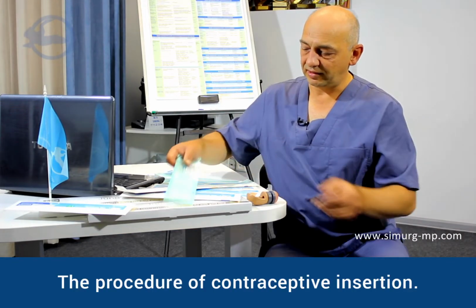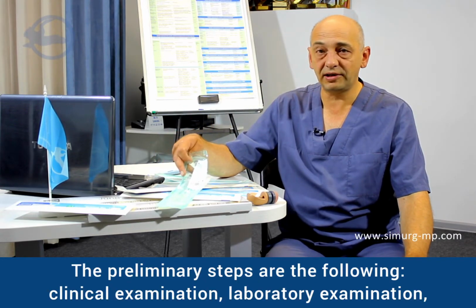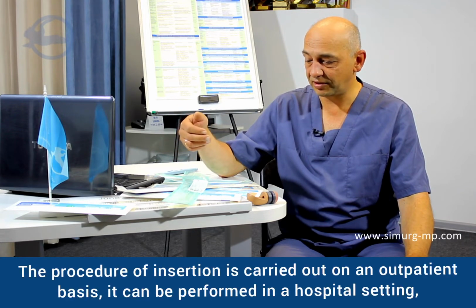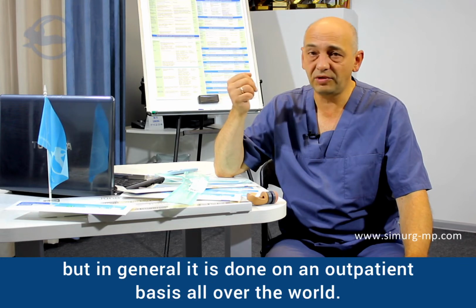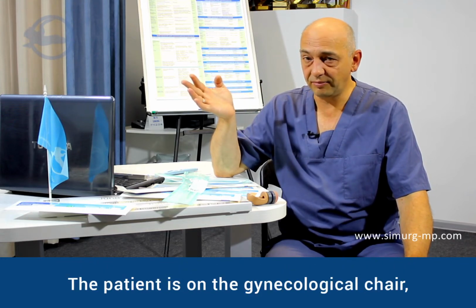The procedure of contraceptive insertion. The preliminary steps are the following: clinical examination, laboratory examination, in order to exclude the contraindications to the use of this method. The procedure of the insertion is carried out on an outpatient basis. It can be also performed in a hospital setting, but in general it is done on an outpatient basis all over the world. The patient is on the gynecological chair.